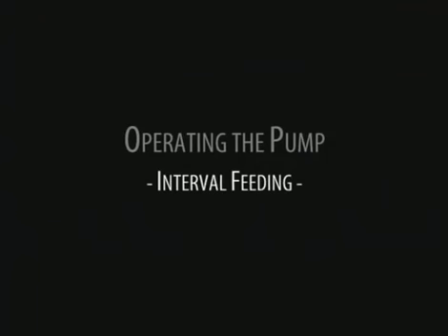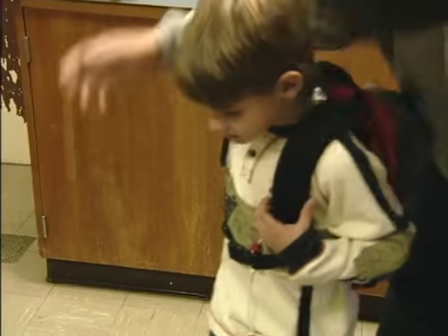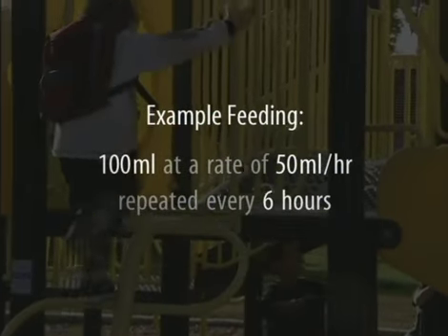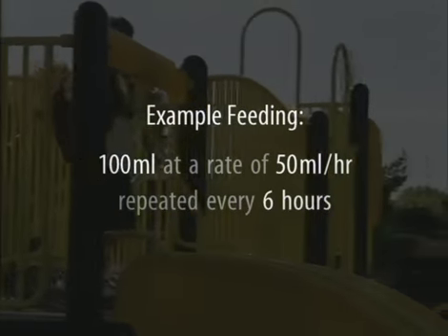If repeated feedings over a period of time are required, adjust the Infinity for interval feedings. For example, you may want to deliver 100 milliliters of formula at a rate of 50 milliliters per hour and repeat this feeding every 6 hours.